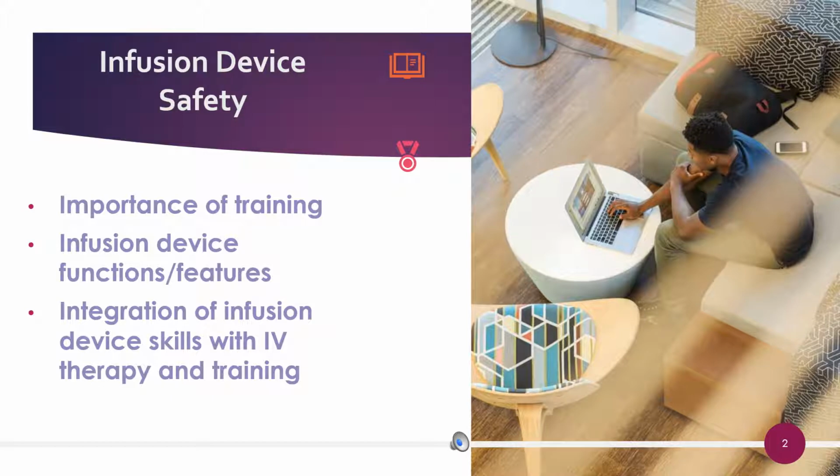Nurses play a critical role in the management of an infusion device, and infusion pump training takes time and practice for nurses to become proficient to administer intravenous medications. This capstone project sought to provide training to senior nursing students on how to program and load a primed IV set into commonly used infusion pumps. Students were shown how to program and load primary and secondary IVs into an infusion pump, as well as preventing and managing some of the common alarms that often occur during infusion therapy.